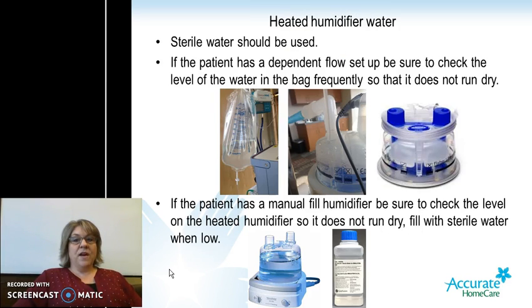The heated humidifier water. Sterile water should be used. If a patient has a dependent flow setup, be sure to check the level of water in the bag frequently so that it does not run dry. If the patient has a manual fill humidifier, be sure to check the level on the heated humidifier so it does not run dry. Fill with sterile water when low.